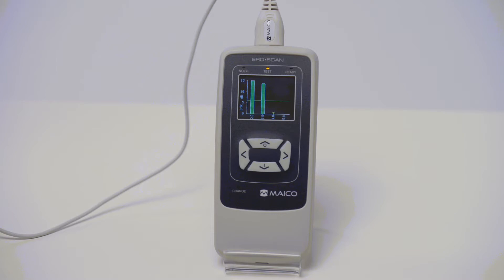Based on settings, the device will store one result per ear. Repeat measurements will replace any stored results within the device.